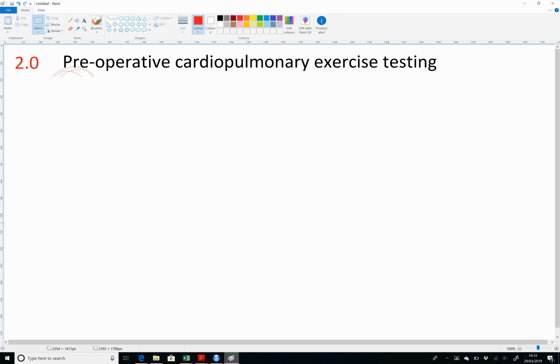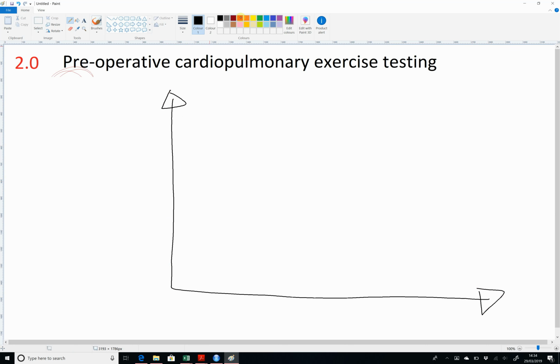begs the question of the most common abnormality, which is lack of fitness or being of less fitness. And perhaps we shouldn't really call it an abnormality. We might preferably call it just less fit than some other people. What we do want to know is whether the value reached is more or less than the average reference population.